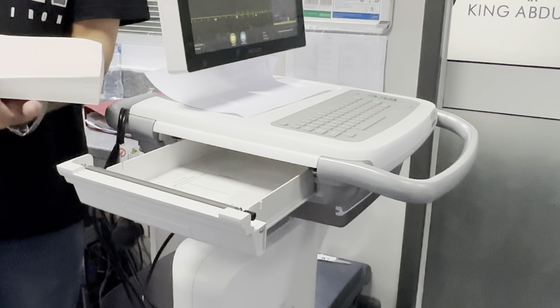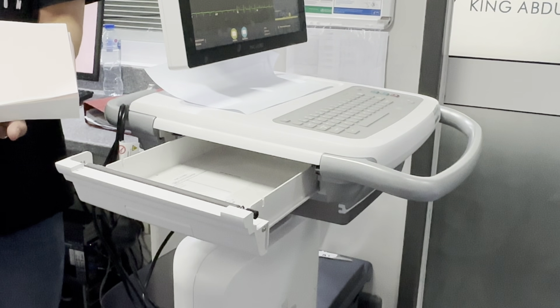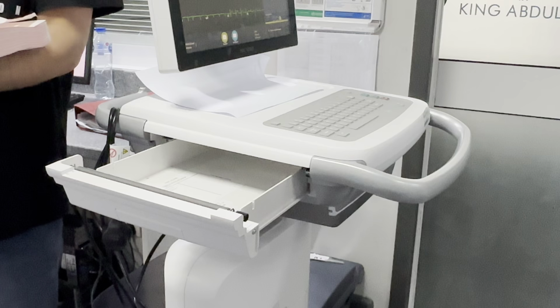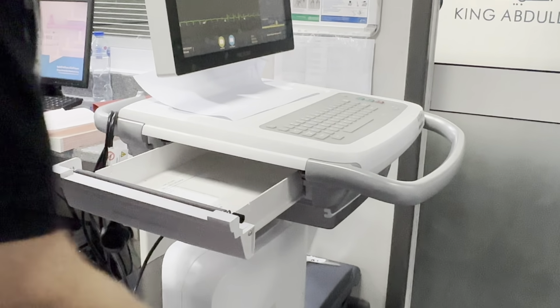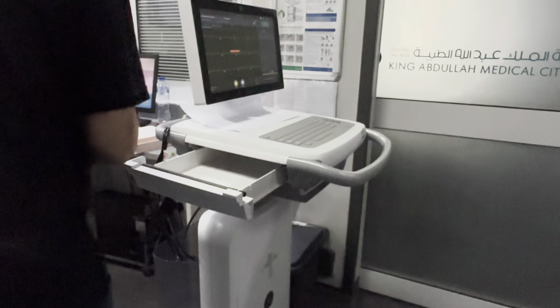This paper is the old version of our papers. It has the reader hole. Your reader hole will be in the upper left part of the machine. It will work fine with the machine, but we prefer to use the other version, which was delivered with the machine. And it has a different indicator.